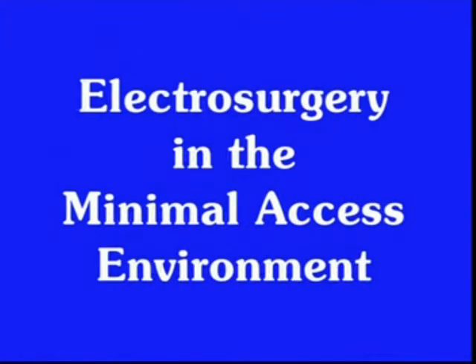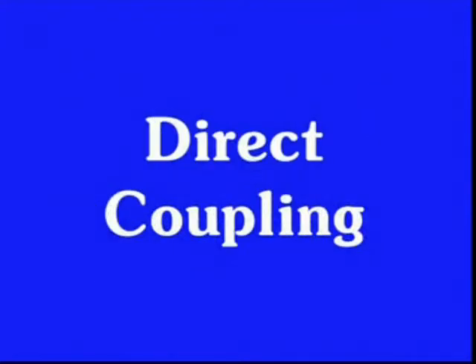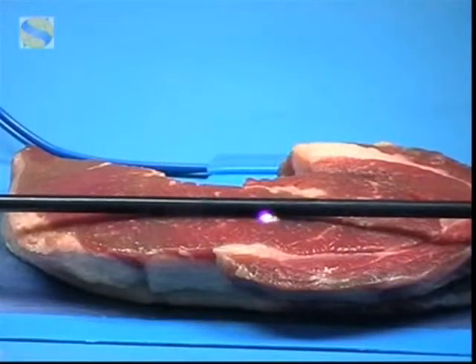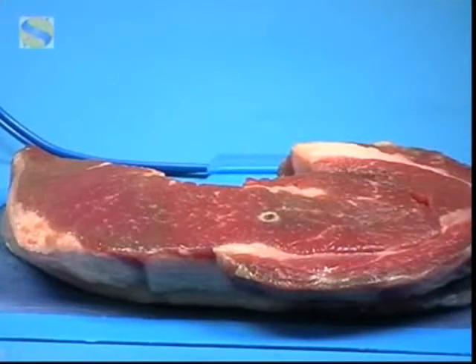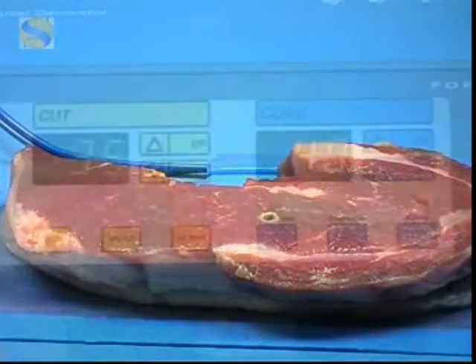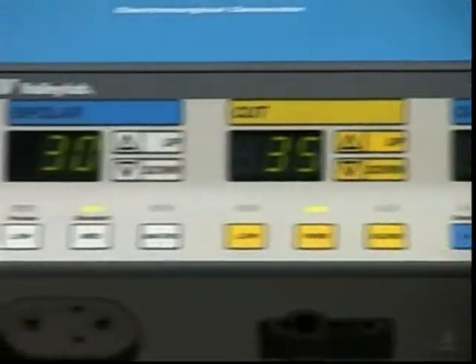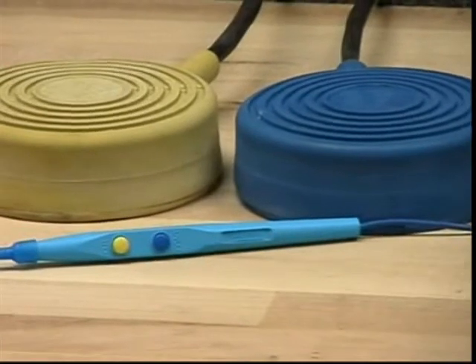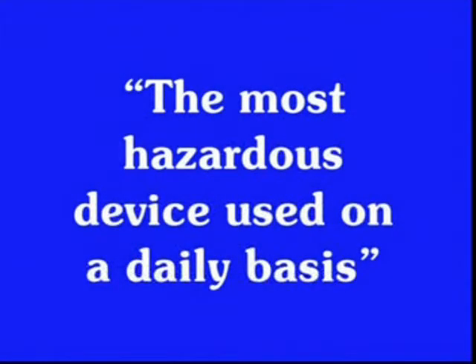You should be aware of the hazards which apply particularly to minimal access surgery, including the concepts of direct coupling, insulation failure, and capacitive coupling. Also, recognize the potential hazards of using coagulating current in the constrained environment of minimal access surgery. And finally, don't forget that the electrosurgical generator has been described as the most hazardous device used in the operating theatre on a daily basis.